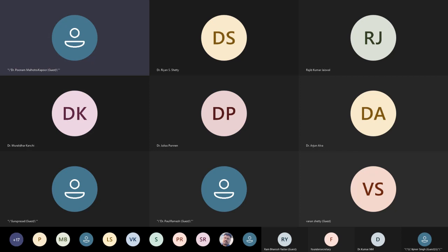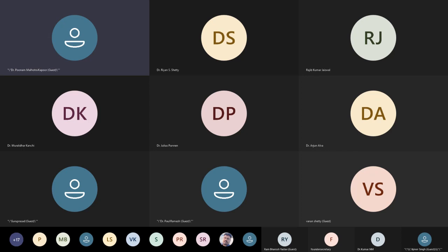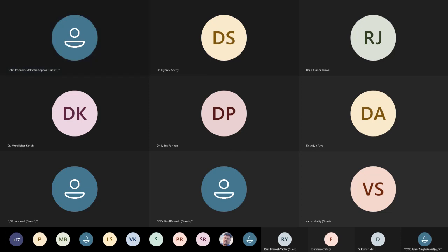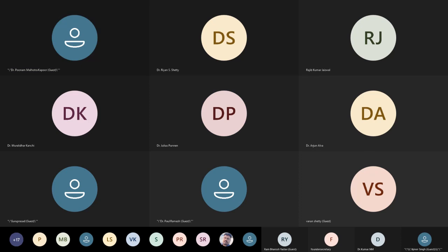The ECMO was on and they wanted us to put a VAD. Now, already there's an IABP and an ECMO, and this is a patient who's been struggling the last 7-8 days, ECMO in and ECMO out. And now with two of them going, where do you put in a VAD in a patient who's not even neurologically feasible to do anything? And then the moment we did the CT, we saw massive intracranial hemorrhage and pointing signs. So those are patients where you feel so unfortunate for them. But I think for commercial gimmicks, we should never allow ECMO to be used as a subsidiary in a false hope to the patient's relatives.